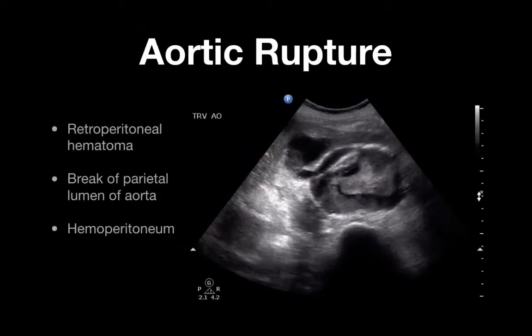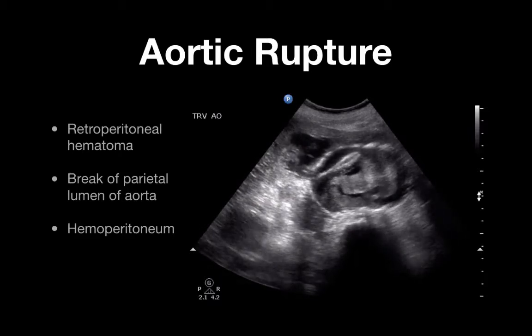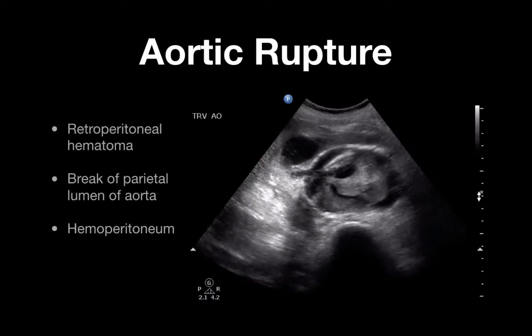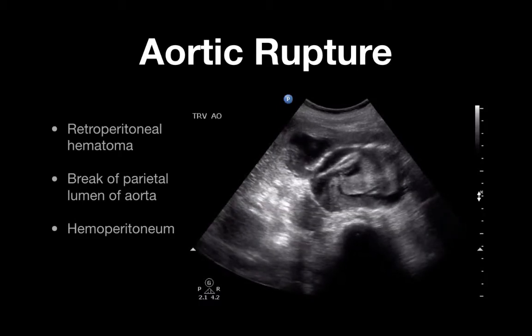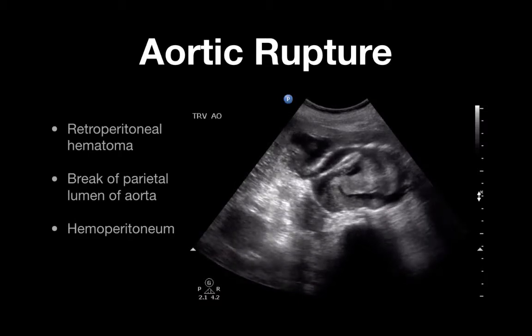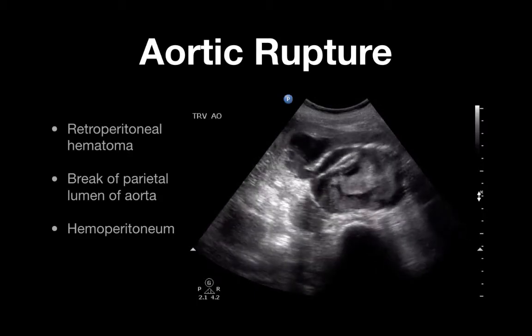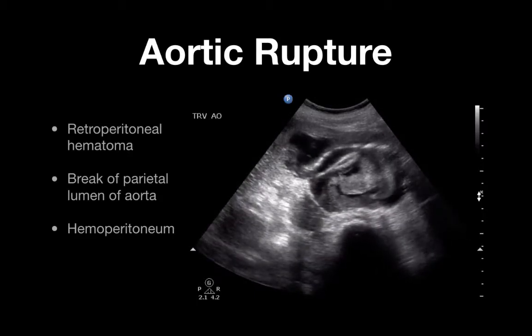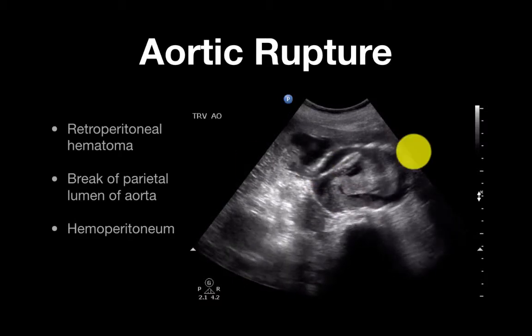This is a patient that I scanned several years ago. She had a known AAA, was an elderly patient, had a syncopal episode and came in PEA arrest. She got a pulse back. It's kind of hard to imagine how. The family was busy talking with vascular surgery about what they wanted to do, and I got a ton of really amazing clips. So this is obviously a large AAA.